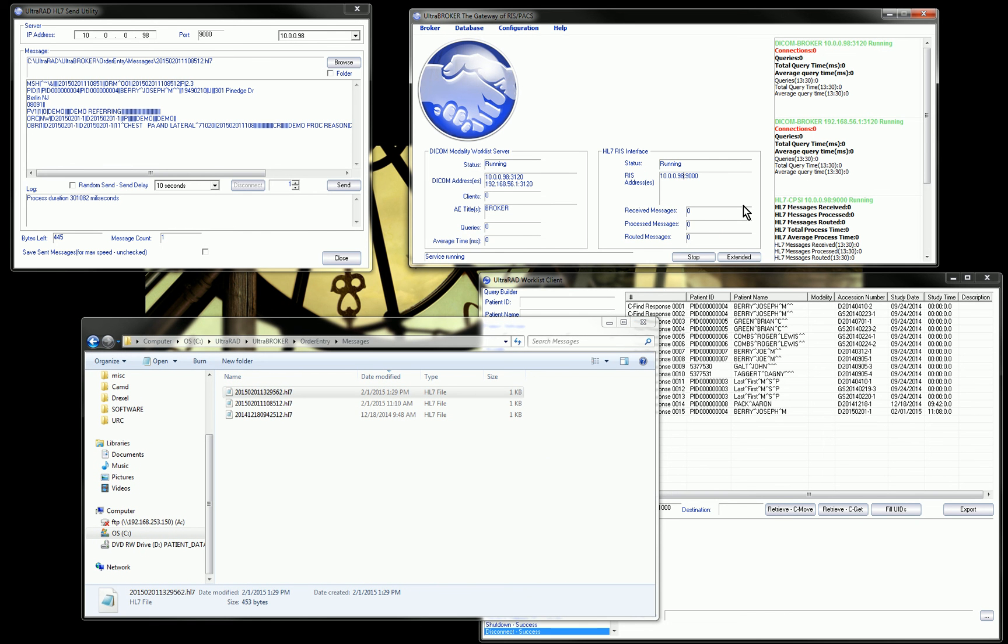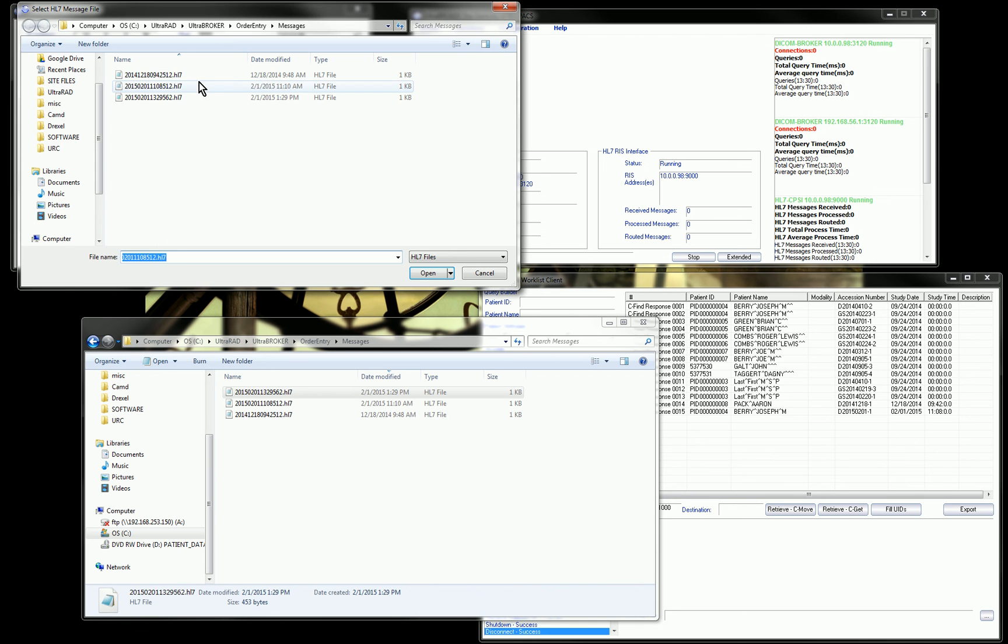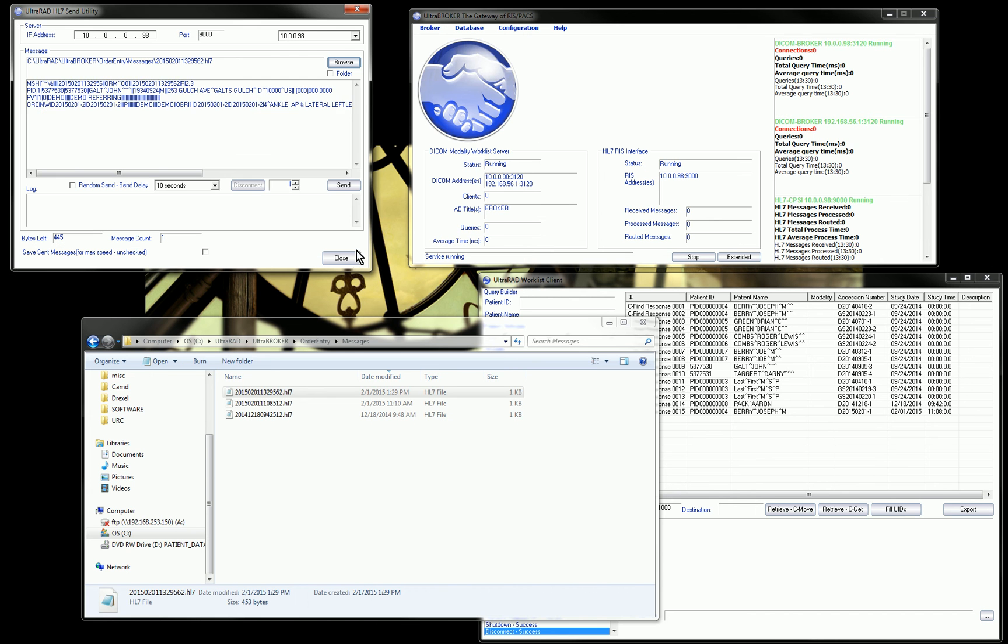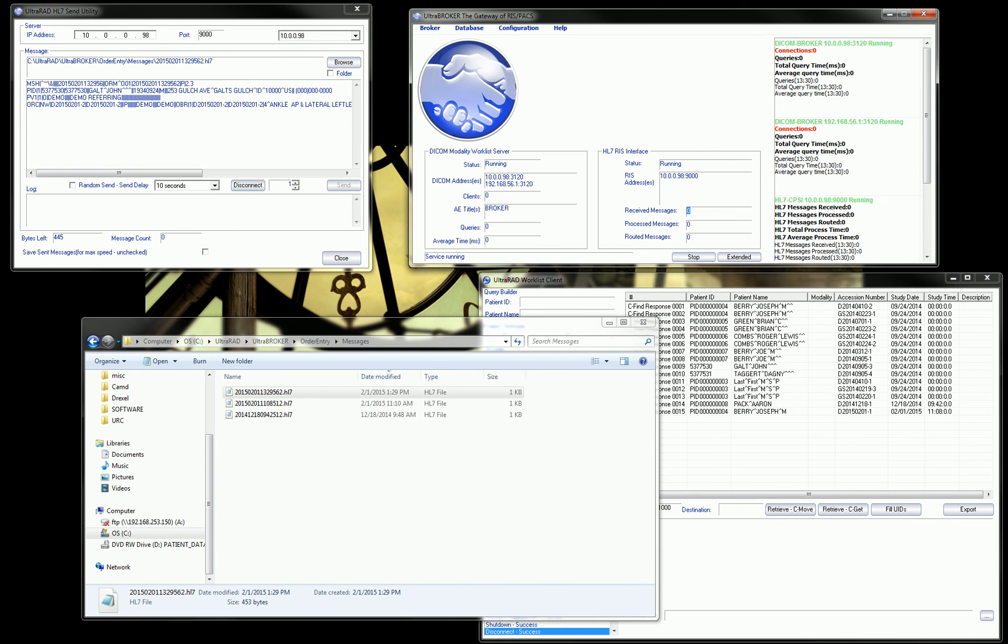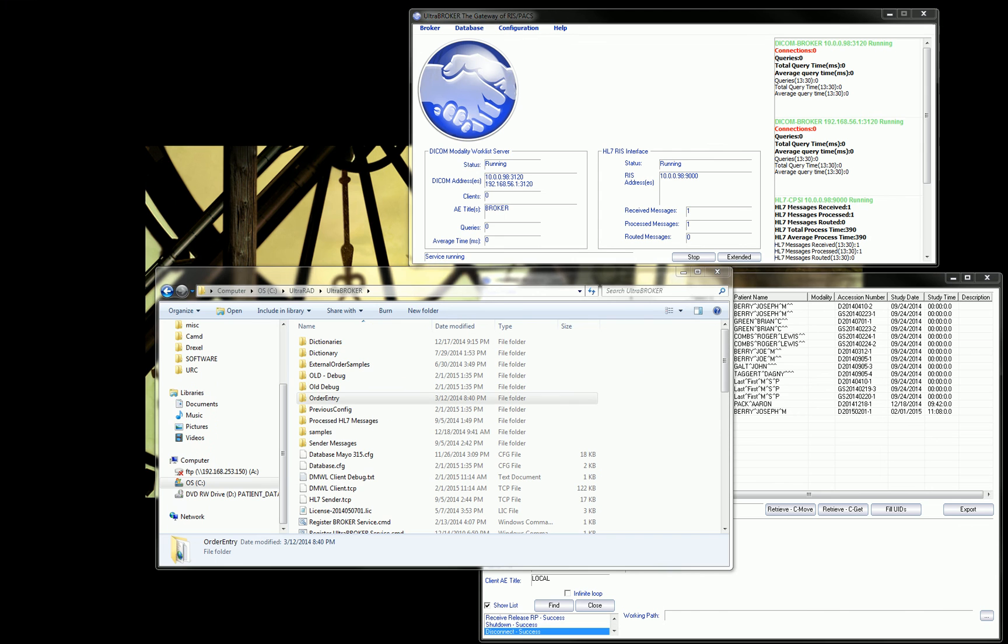In some cases that HL7 message would get sent to our broker. Here's the broker up here on the upper right-hand side. You can see I've received no messages so far. I'm going to go over here. I have a little tool that I can use to send HL7. I'm going to go and find that message. Here's the message that I just generated. I'm going to click the send button. You'll see over here that this number is going to increase to 1 once that message is received.